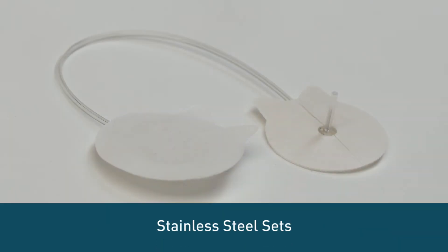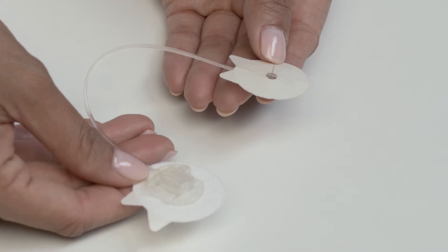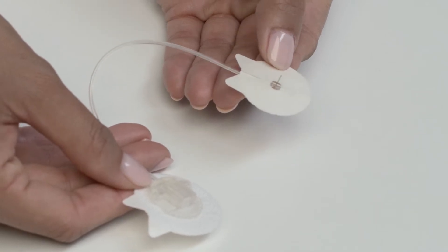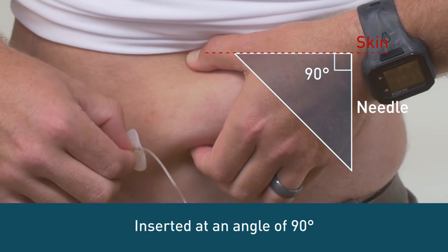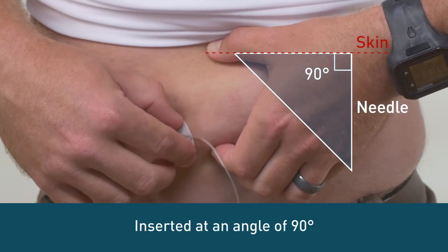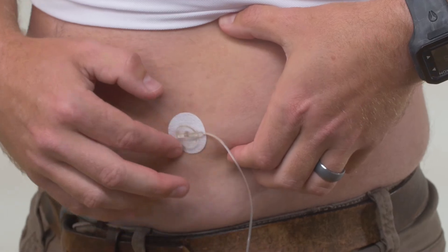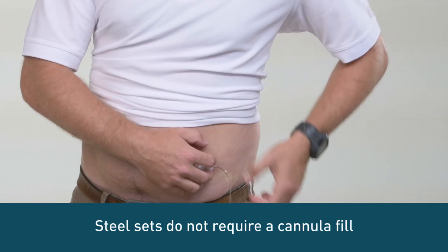Stainless steel sets use an ultra-thin 29-gauge steel needle inserted at a 90-degree angle instead of a flexible plastic cannula. Steel sets are inserted manually and are available with a 6 or 8 millimeter needle. Since the needle serves as a cannula, these sets do not require a cannula fill.